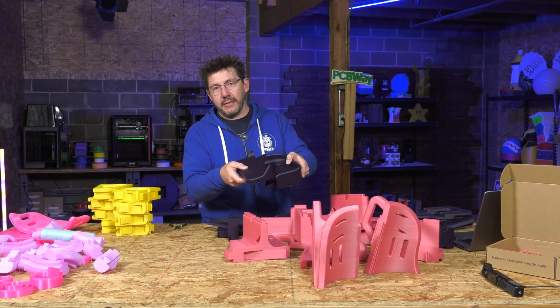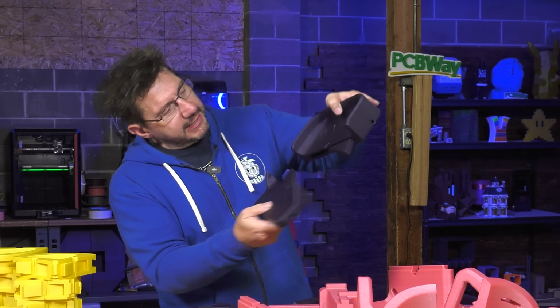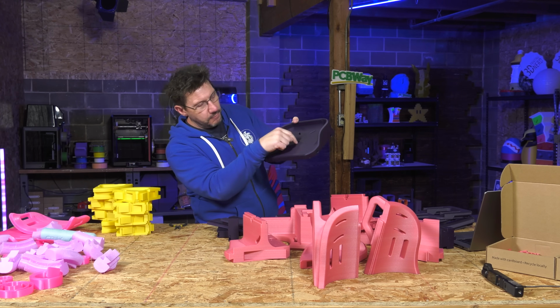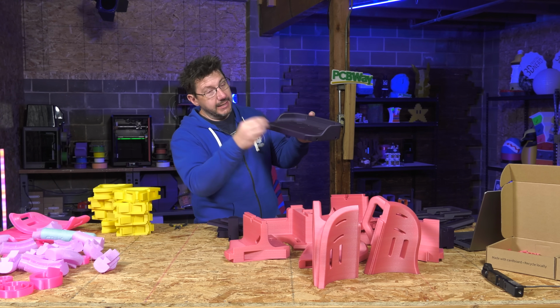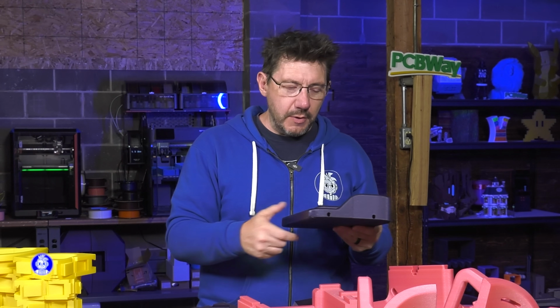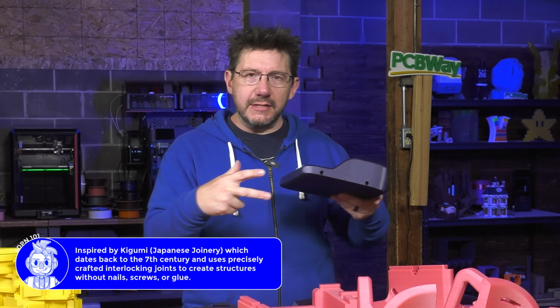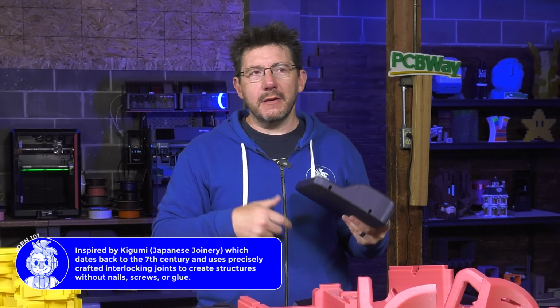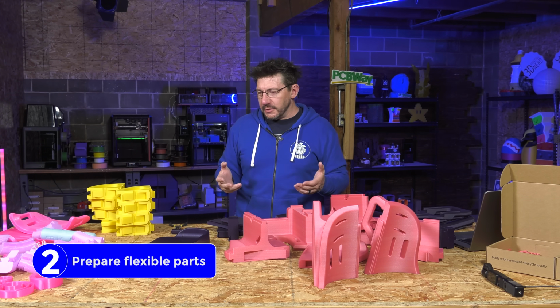These pieces go together. This is the foot plate, but they have these parts that stick out, and so when you slot that together, you then put where's one? Here we go. This little piece, it's not this one, it's a different one, but you put this in and then you pound it in with a rubber mallet and that locks it in. So you have these two pieces interlocked and then this locks it in place, and it is an amazingly strong connection. The next thing you have to do is prepare your flexible parts.